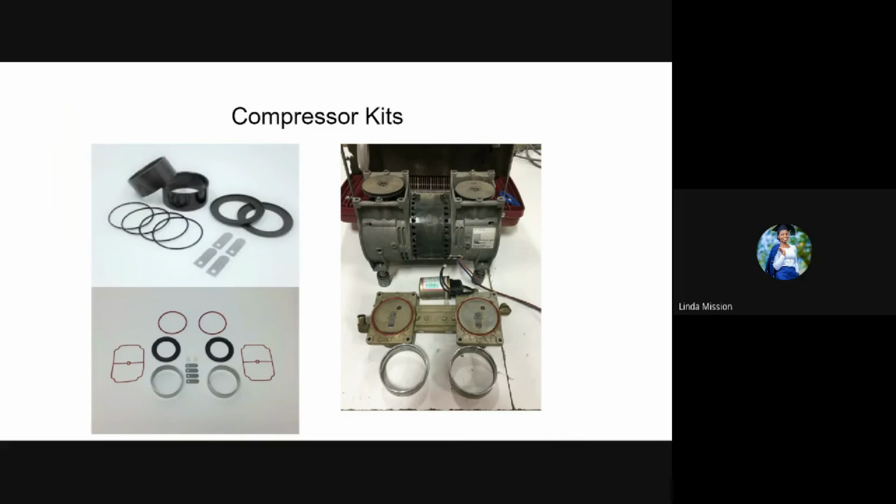In addition to producing low pressure, which results in low oxygen purity, when the piston caps and cylinder sleeves inside the compressor are worn out, the compressor produces a loud squeaking sound. This is because the cap retainer inside the compressor may be hitting the sleeves as the piston is moving up and down. Sometimes the squeaking sound may not be there, but the sound of the compressor usually changes, and it is loud when the service kits have worn out.